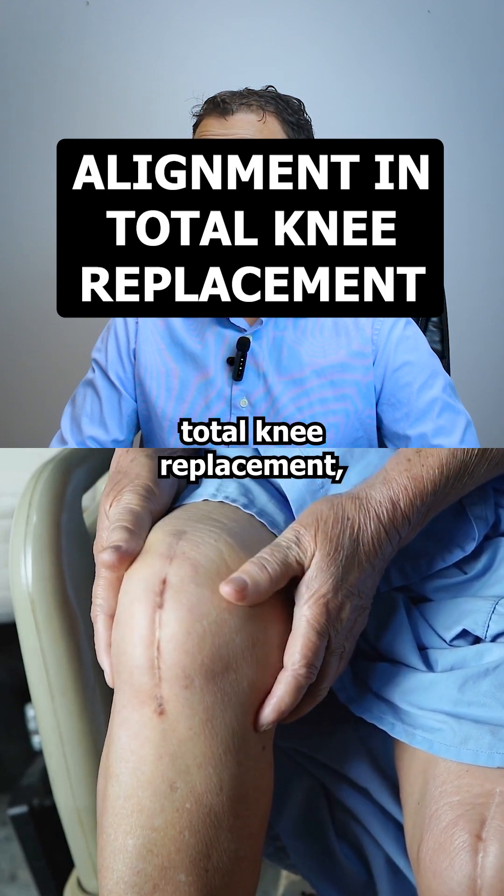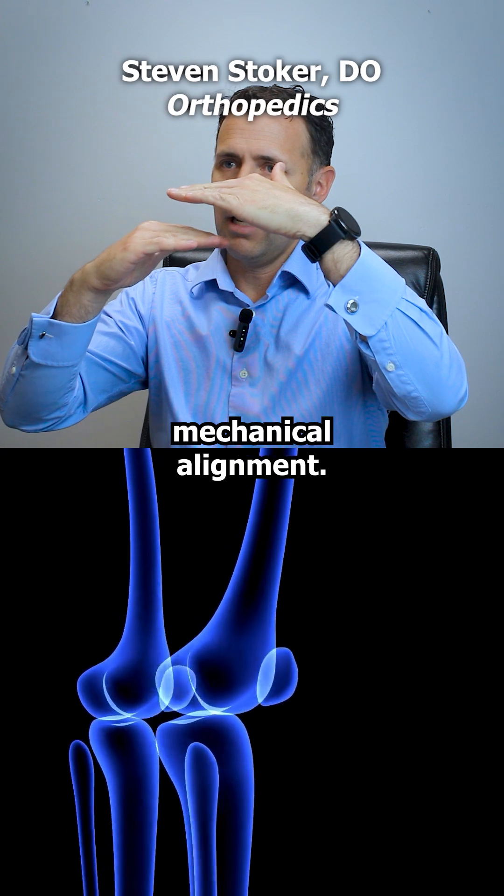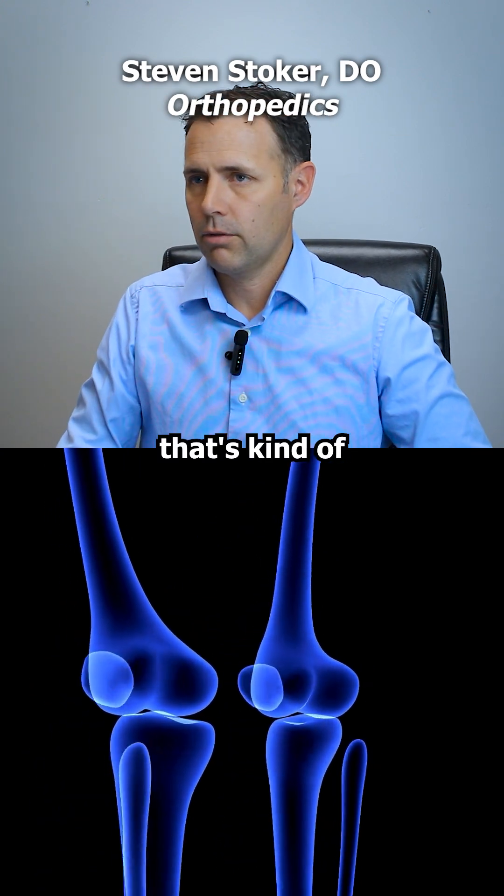Since we started doing total knee replacement, people were kind of aligning the knee to the floor. It's called mechanical alignment, and that's kind of the gold standard.